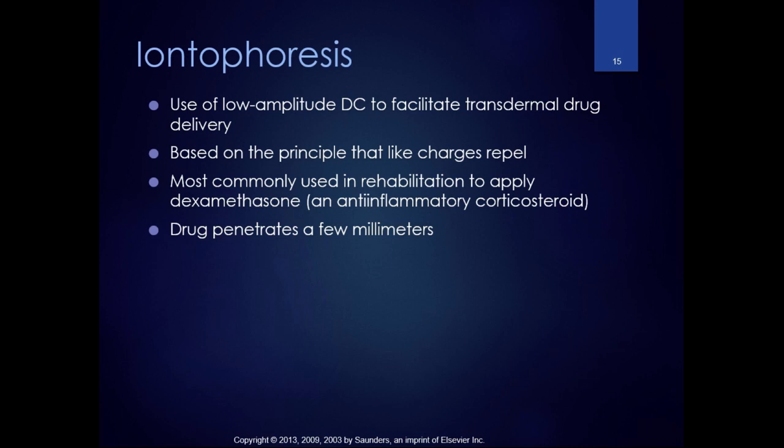So it's based on the principle that like charges repel. So dexamethasone's negative, you have a negative electrode that you inject the dexamethasone into, you put it on the skin, you have a positive dispersing electrode at a distant location, and the electrical current drives the corticosteroid dexamethasone into the skin.